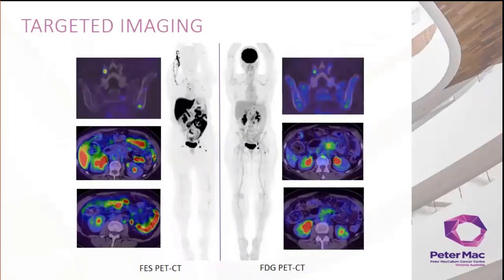So finally, tumour heterogeneity. This is a well-established histological and imaging finding in so many tumours, including in breast. So our imaging ability to prove this allows assessment of appropriateness of targeted treatments and earlier assessment of effectiveness of treatment. FES is finding its place slowly within this, despite having been around for a long time. We have most frequently discussed its utility clinically in cases with treatment-defining imaging findings, usually solitary bone findings, where biopsy would be difficult or dangerous.